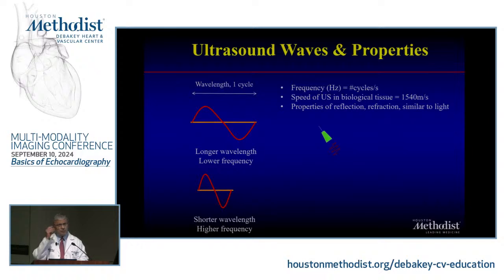For those of us who grew up in mountains and you can hear your echo after a while, just imagine you send a sound and you wait for it to come back, so it bounces against the mountain, comes back to you. But if you keep screaming all the time, you'll have no idea, right, because you're merging your own voice with the reflected wave.